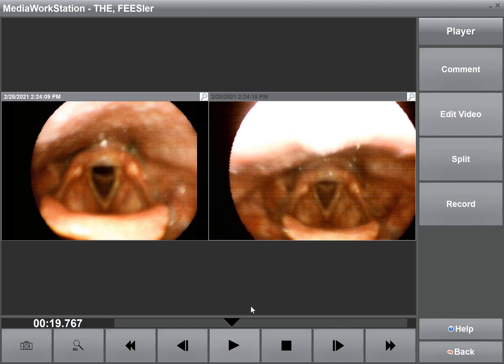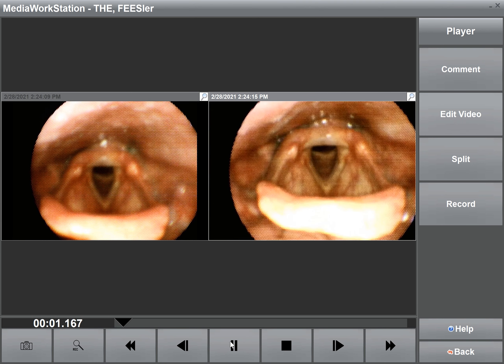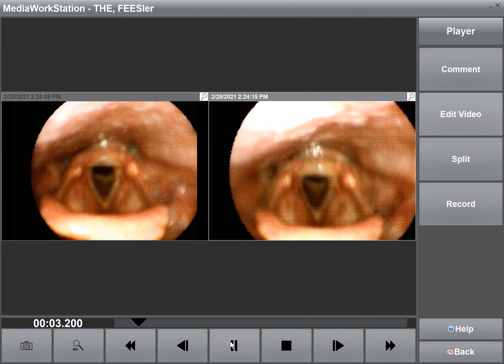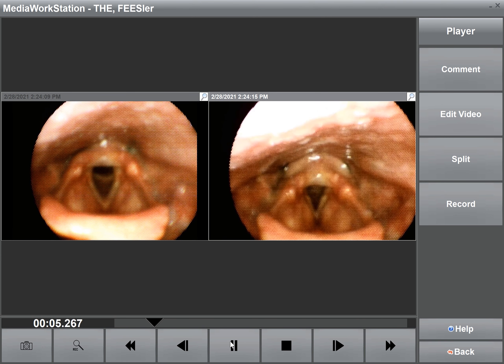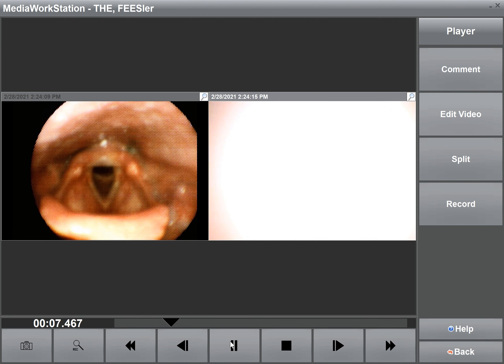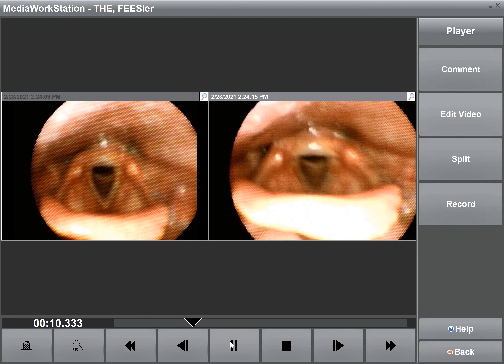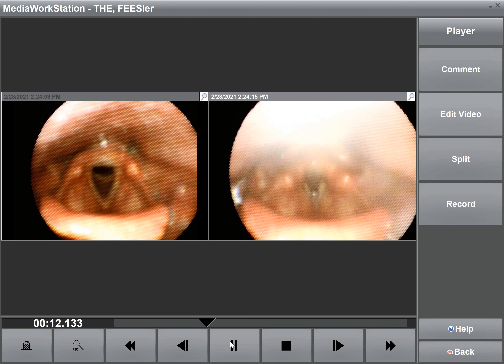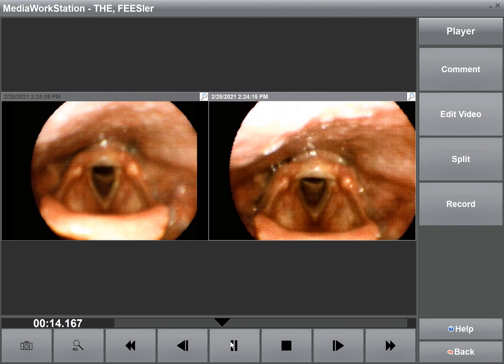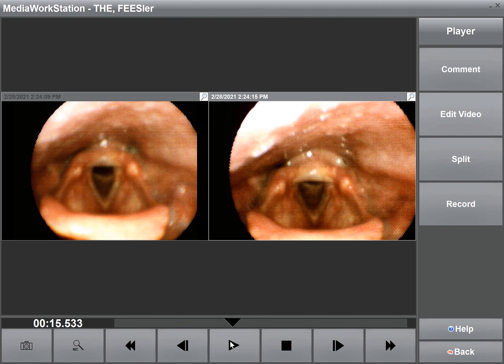In contrast to that, let's look at three consecutive swallows without automatic exposure. You might have already seen the difference in the two video clips, but let's go ahead and review them frame by frame.